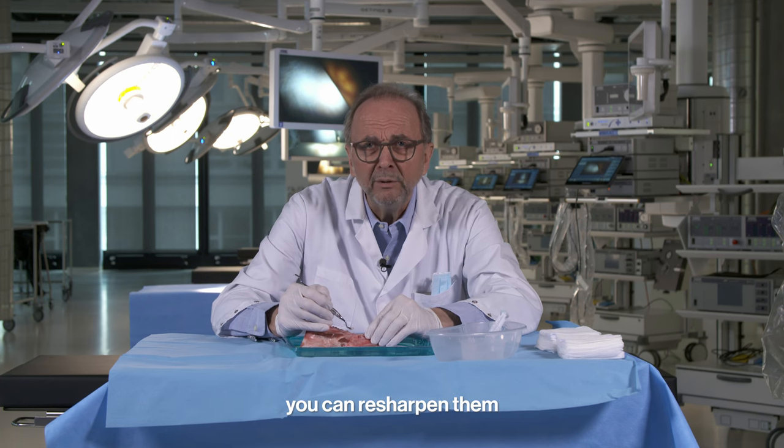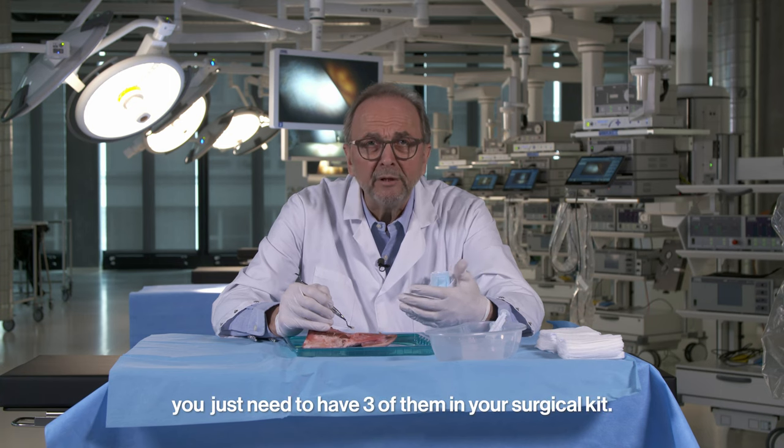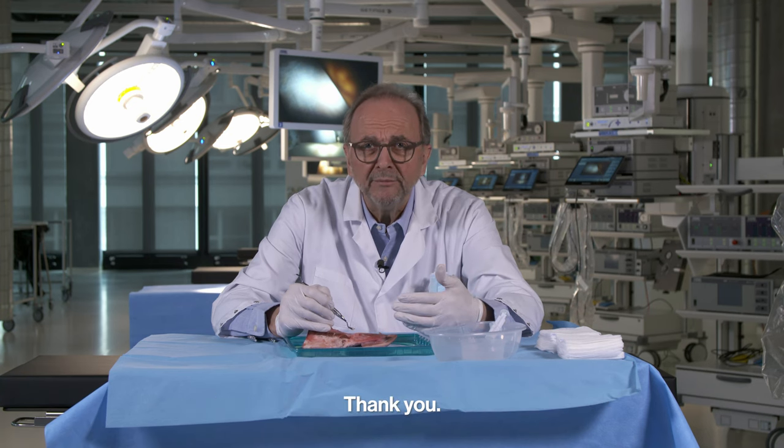That's all I can tell you — it's very simple. You can resharpen them, and you can use these instruments for years. You just need to have three of them in your surgical kit. Thank you.